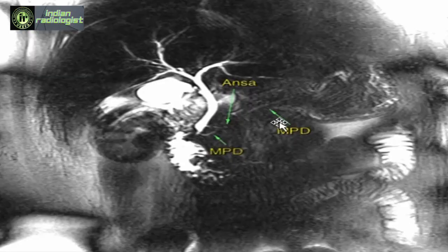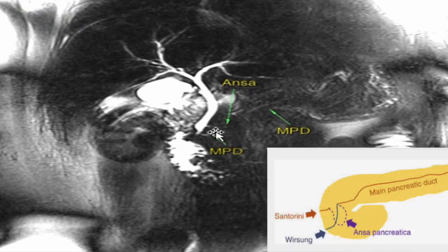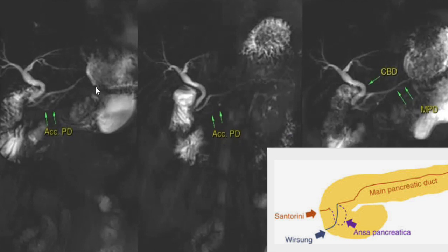This is a thick slab MRCP image of a patient with carcinoma gallbladder. The main pancreatic duct is seen to form a confluence with the terminal CBD and drain into the major duodenal papilla. An accessory duct is seen arising from the main pancreatic duct forming a small loop, crossing the CBD and draining into the minor papilla. These findings are consistent with ANSA pancreatica, which is a predisposing factor for pancreatitis.